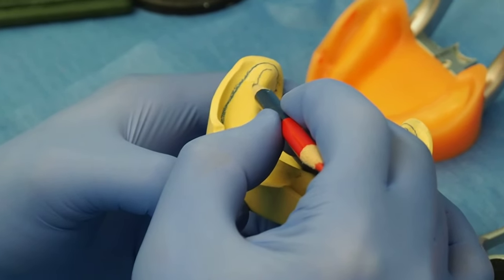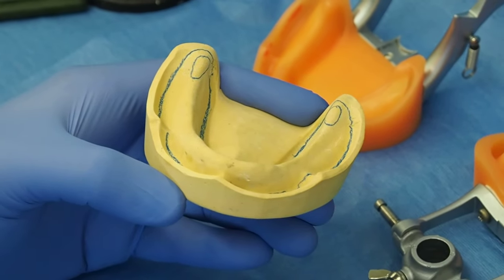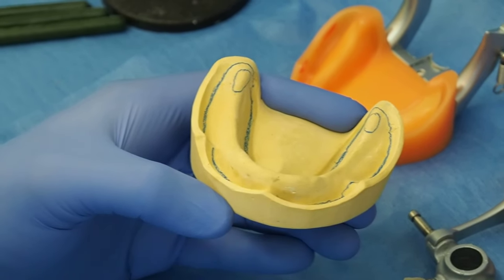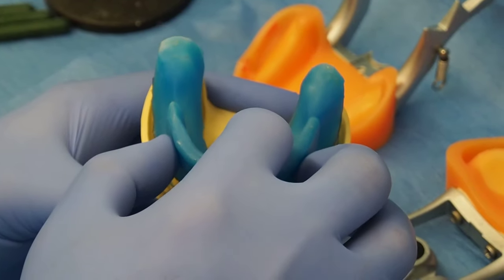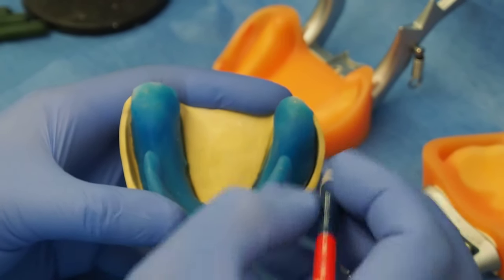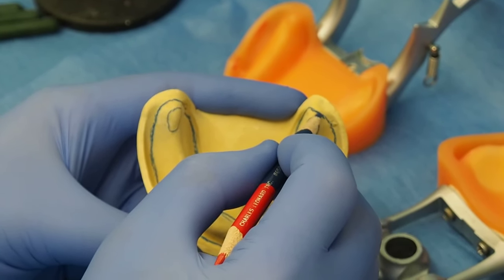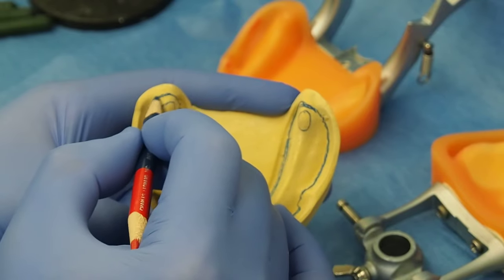We'll see two protuberances right here that will guide us when we're setting up the teeth. As far as for now, I want this custom tray covering all the way to the back.